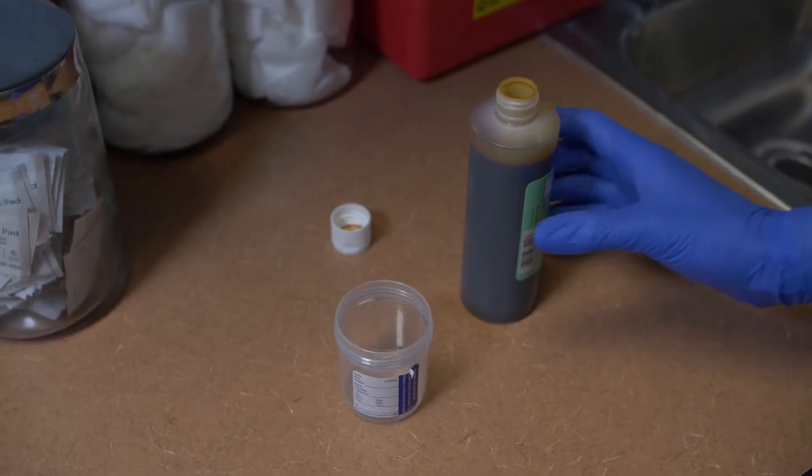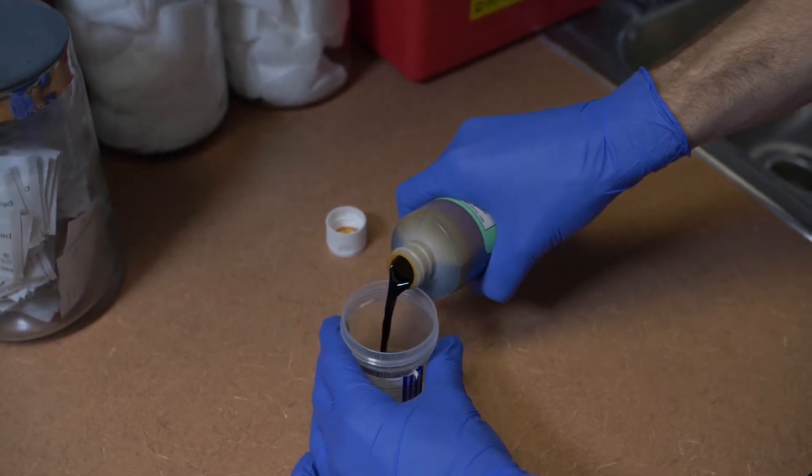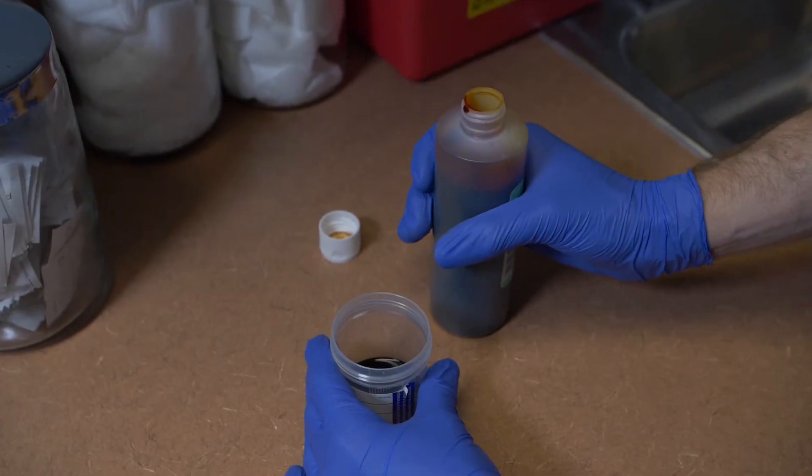Place your palm over the label to protect it from any stains. Pour a small amount of the solution into a bowl, a cup, or into the sink that is outside of the sterile field.